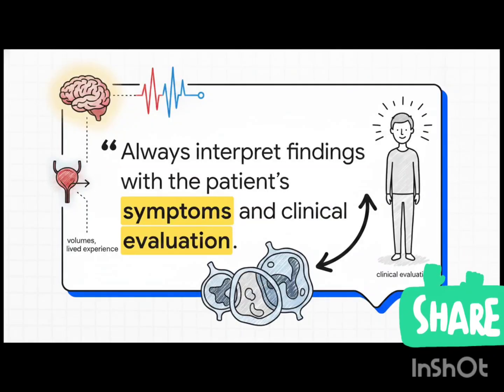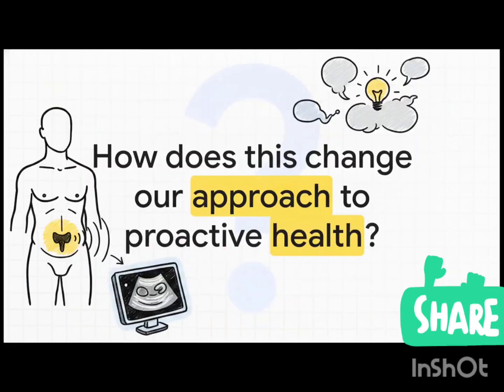But, and this is absolutely vital to remember, data on a dark screen is really only half the story. The clinical guide leaves us with this mandate: always interpret ultrasound findings together with the patient's symptoms and clinical evaluation. All of these complex, high-tech visuals, the volumes, the trabeculation, the anechoic voids, they honestly only matter when they are anchored back to reality. They are tools to help diagnose and explain a real patient's actual lived experience and daily symptoms.